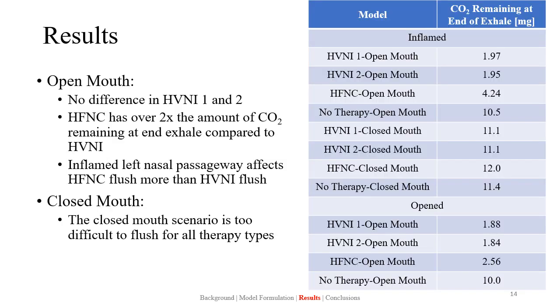A table containing the results for all 12 models run in this study is shown on the right. For the open mouth cases, there is no difference in HVNI1 and HVNI2 with both an inflamed or opened left nasal passageway. HFNC has over 2 times the amount of CO2 remaining at end exhale when compared to HVNI for an open mouth inflamed case.